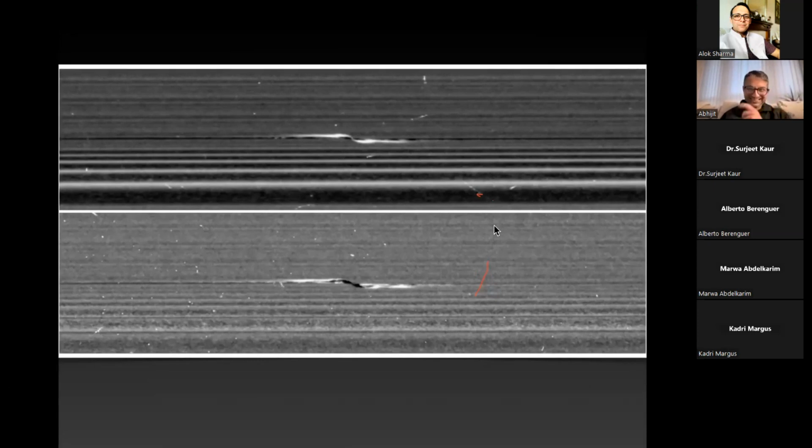Is it a bottle of champagne, if anybody can guess? It looks like a mirror image, sir. It's a little less echogenic. Probe and M mode. Right. So this is, guys, okay, this is none of those.